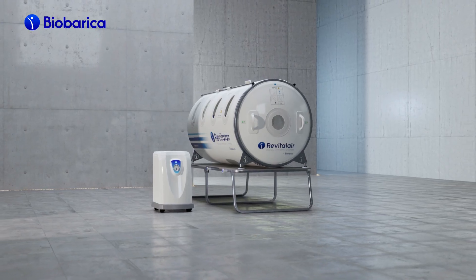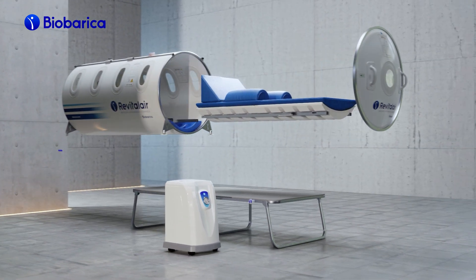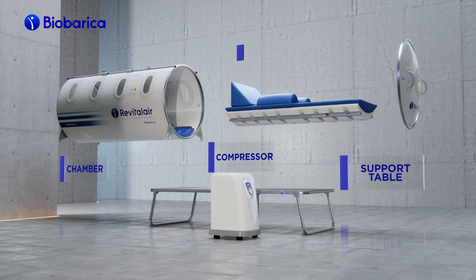The Hyperbaric Chamber Revital Air 430 is a medical device of high therapeutic efficiency, composed of the cabin or chamber itself, the compressor cabinet or compression system, the support table, and the integrated stretcher.